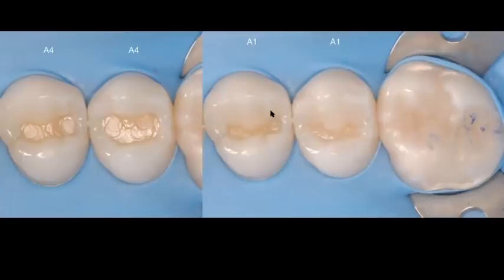Again, this combination is one that I use 80% of the times. I'm not really selecting a shade for posterior teeth. I'm just combining A4 and A1. I would say 20% of the times, if my patient's teeth are very, very yellow, I may combine A4 and A2, but those are normally the combinations that I use to get these type of results. So here you can see I've done the same on both of the premolars. I've only created an oblique layer for my buccal cusp. And now I'm going to go to the next slide.